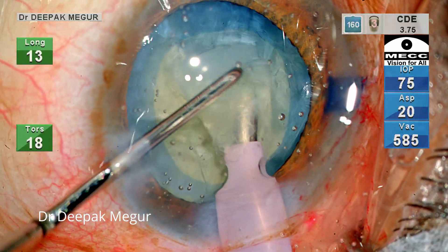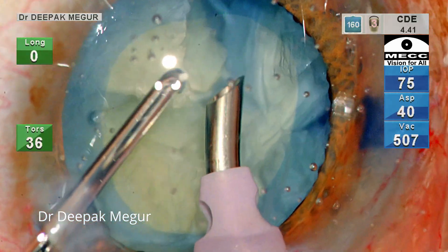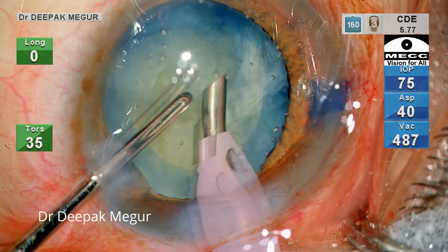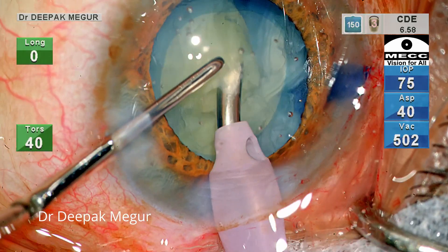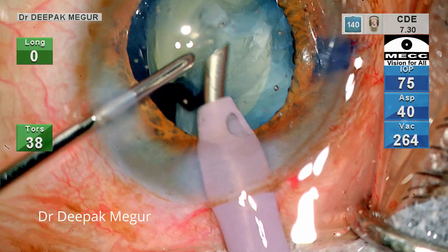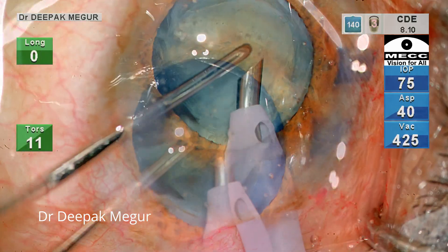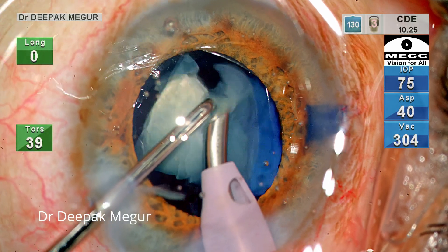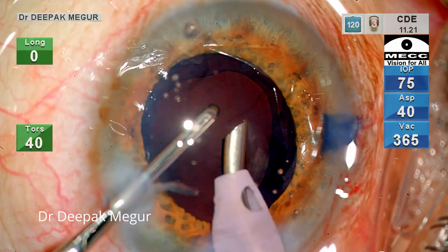The nucleus has been divided into multiple fragments and each fragment has been emulsified. Please note the position of my tip here — this is the typical position I would like to keep when aspirating the fragments. It is tilted towards my left side and gives more surface area exposure for the nucleus to attach itself. This allows efficient use of ultrasound energy and better occlusion with this tip orientation. In just a couple of minutes, the entire nucleus is emulsified and aspirated out.